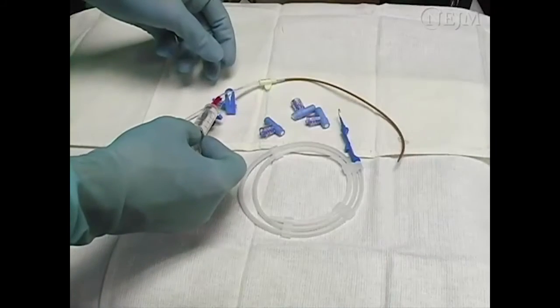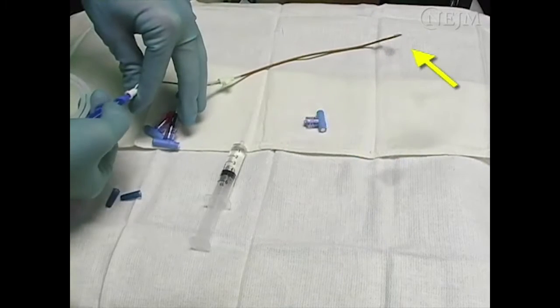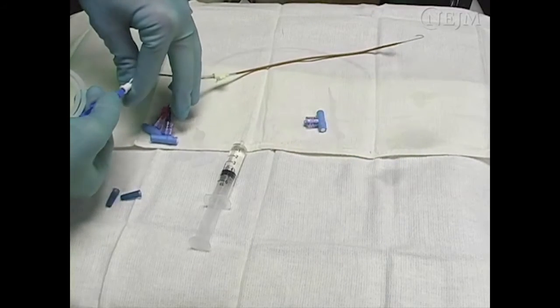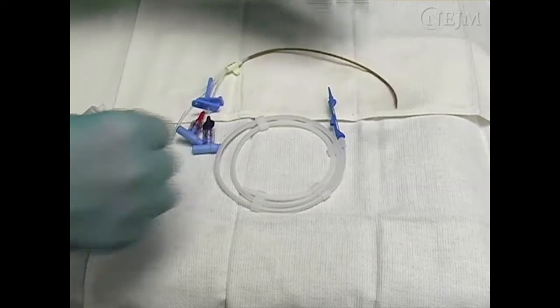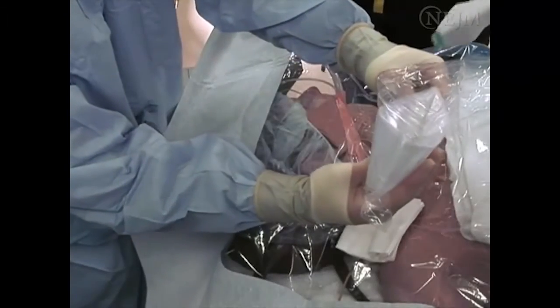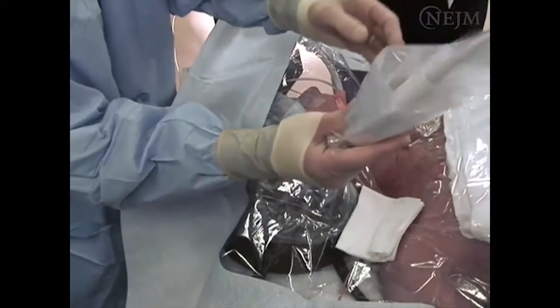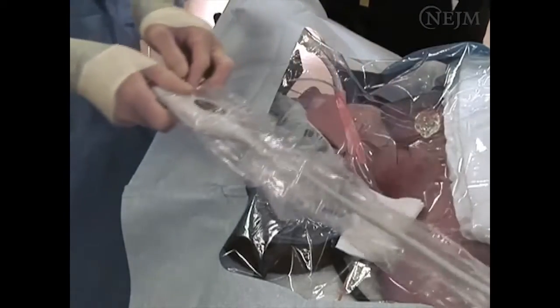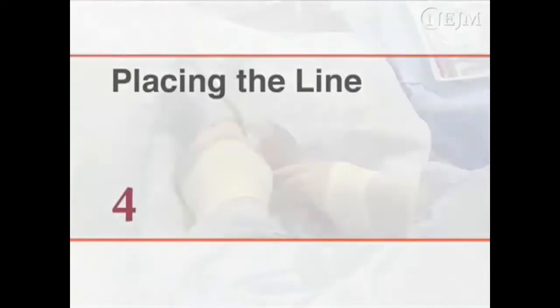Flush the lumens of the central line with saline or heparin and ensure that the guide wire threads easily through your needle. Remove the cap from the port through which the guide wire will be threaded. This is commonly the longer lumen. If using ultrasound, prepare the ultrasound probe with a long sterile sleeve, being careful not to contaminate the sleeve prior to placing it on the sterile field.